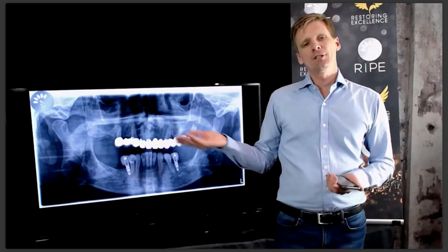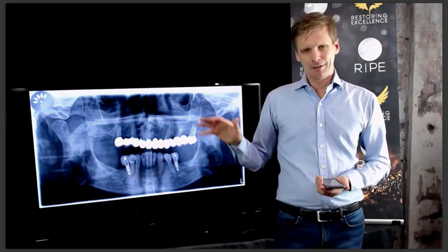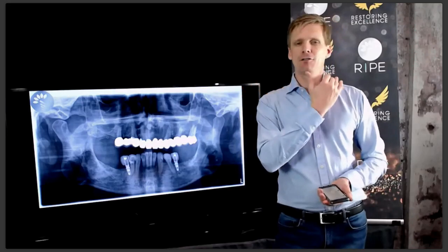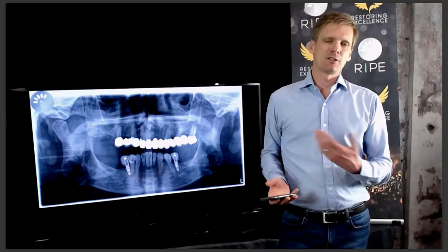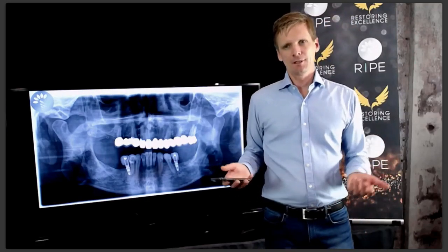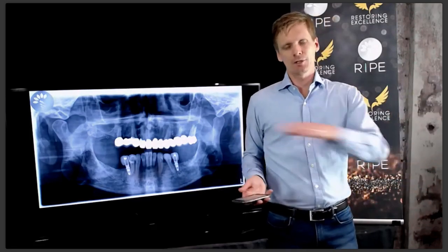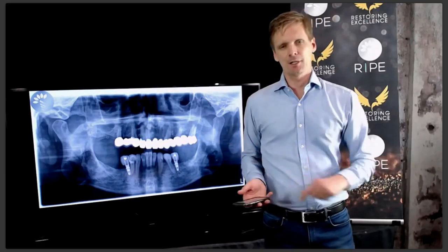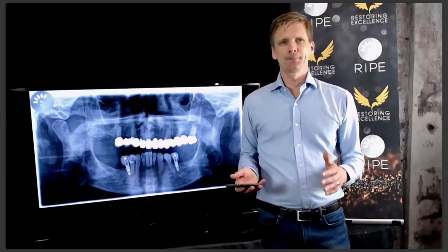If the jaws are not level, then you must level them, because you're going to make the upper teeth match the lower teeth. If the lower teeth are all wonky like this, then you have to make the upper teeth all wonky to match. You can hide it on the front, make the front look nice, but the occlusion of the upper teeth will look awful. So in those cases, you need to do some sort of mock-up over the teeth. If it's short-term, I would just do a bisacryl mock-up like Luxatemp or ProTemp. You bond it straight over the top of the teeth. If it's long-term, then I personally do a freehand composite. If you're just doing it to level the lower arch only, then just put it straight over the top of the amalgams and fillings and everything.